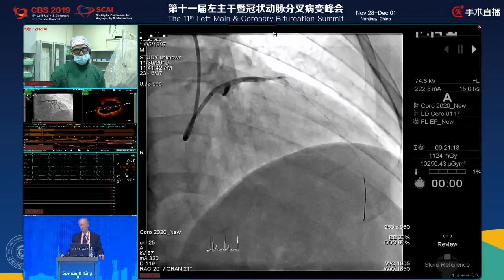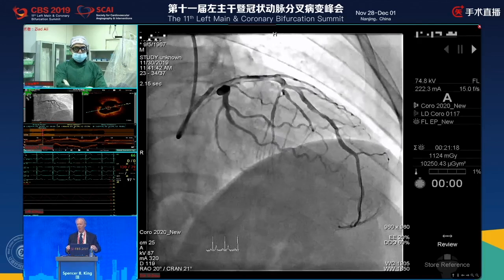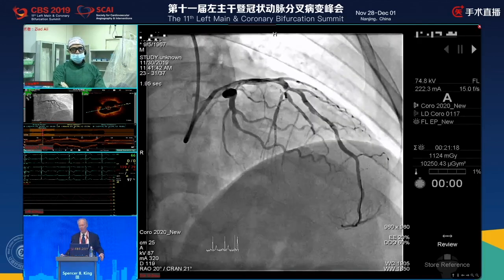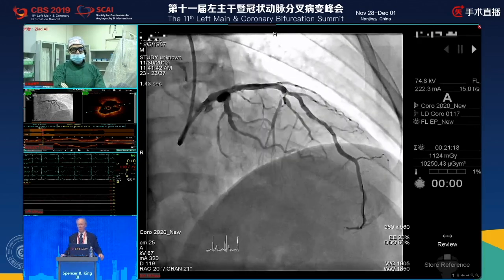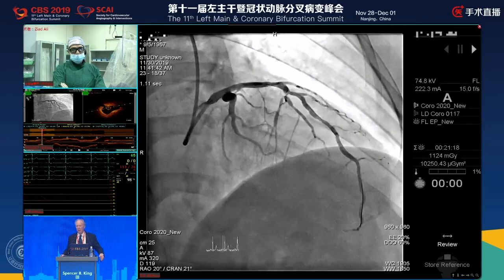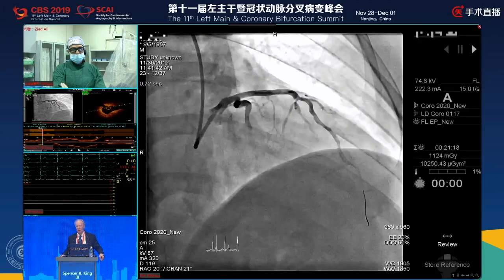Well, we've learned a lot from you about this Angio-FFR, and I think it has been very interesting to have a look at that. I think maybe we could check the other room and see if a solution has been found to this obstruction with a stent or in the LAD. Yeah, no, you want to ask them something? Yeah, I have one question.